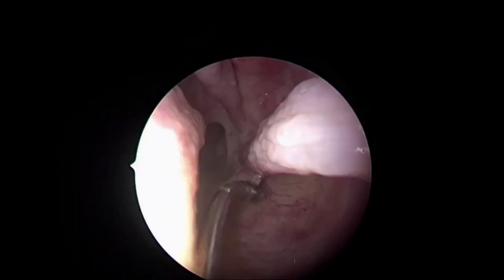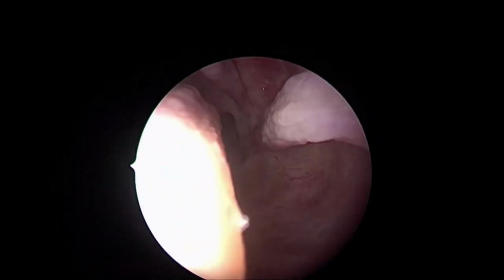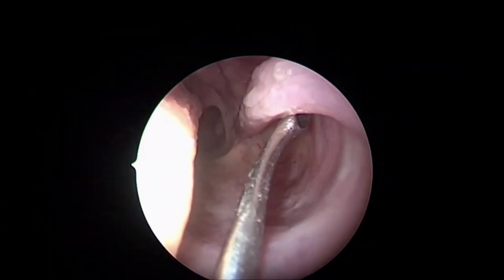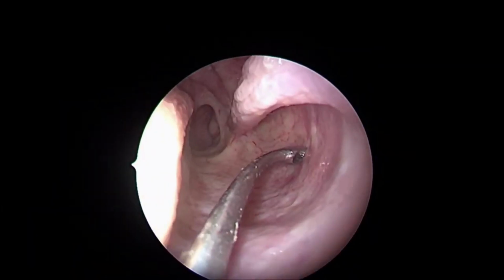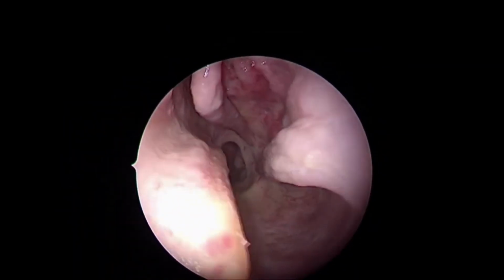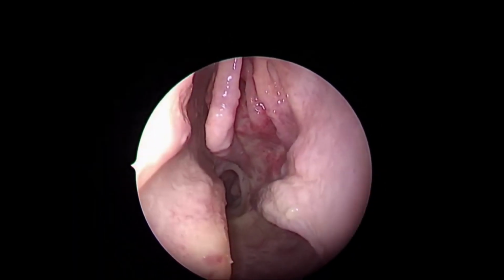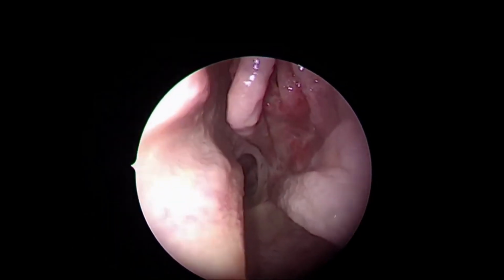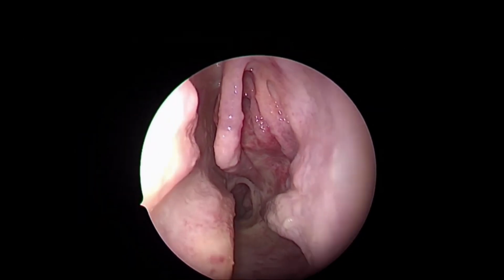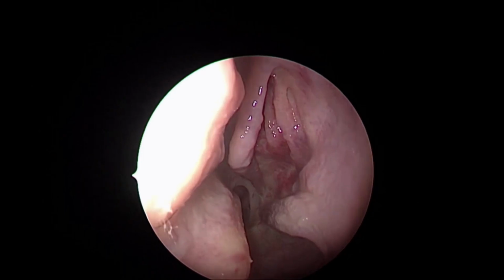So when you carry out the inferior meatal antrostomy, though nowadays it is almost obsolete, do not run towards the roof at the attachment of the inferior turbinate, rather stay in the floor and a little behind, so as to avoid injury to the nasolacrimal duct. It was earlier considered for the drainage of the sinus, and after Messerklinger and Stammberger revolutionized the concept of the drainage pathway of the paranasal sinuses and sinus surgery came in, this procedure became obsolete.